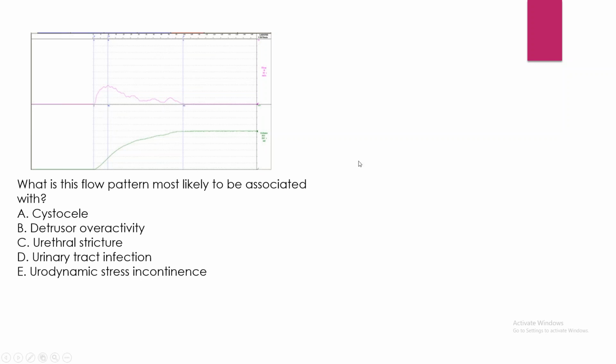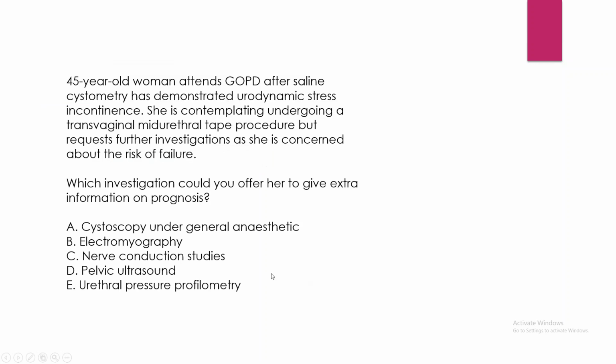It's a cystocele, external obstruction. It is bladder outlet obstruction, but from outside. So it has plateaued slowly. Correct? So it is cystocele.